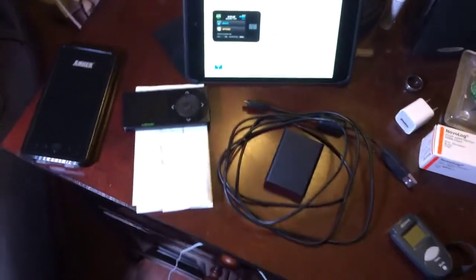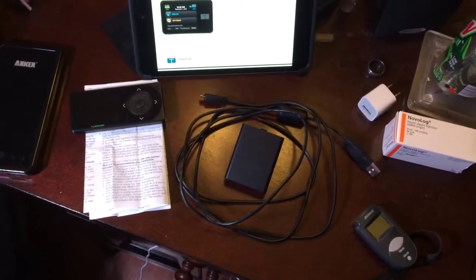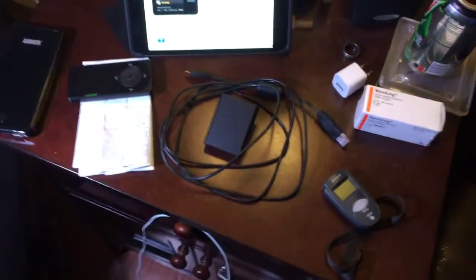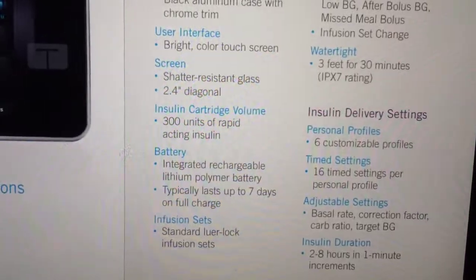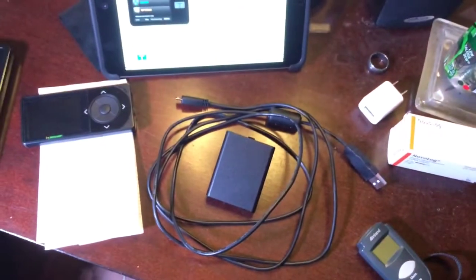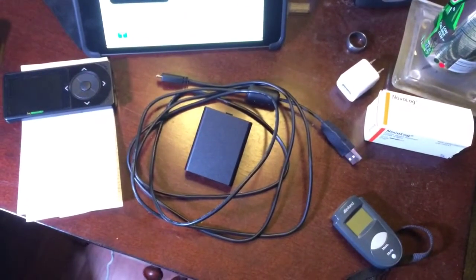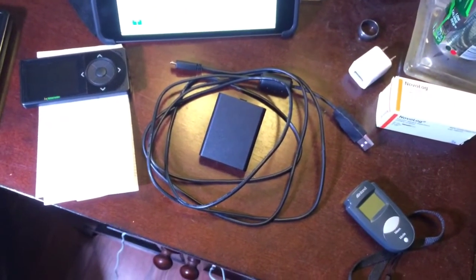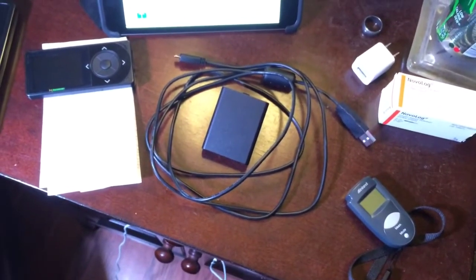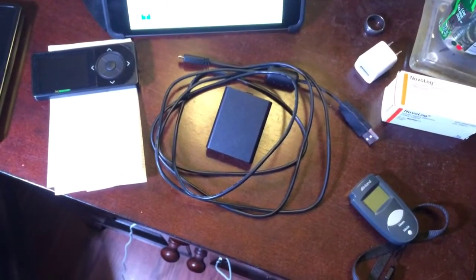Tandem does recommend charging the pump on a daily basis, or at least topping the battery off. I'm actually bad at that — I don't do that. According to their spec page, it includes a lithium polymer battery. If you know anything about lithium polymer, when they're done they'll just die off. Most likely T-Slim has circuitry in place that will prevent the battery from going below 3.3 volts, since it's likely a single-cell battery, preventing damage — those batteries are not supposed to go under 3.3 volts.